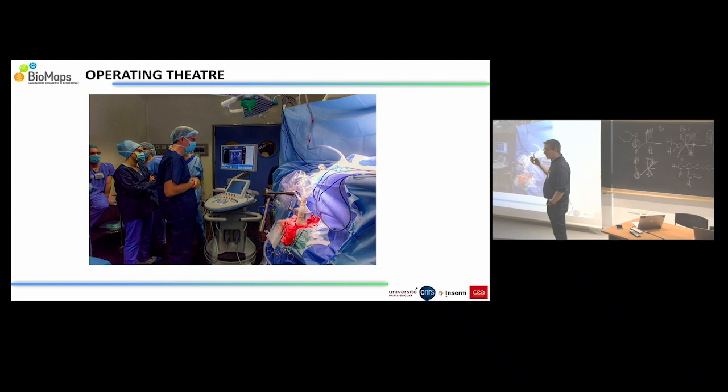He can do that at the surface of the brain, but not in depth. So here we come with the ultrasound in order to see in depth where the activations are made, to help the neurosurgeon resect the tumor without touching the functional zones.